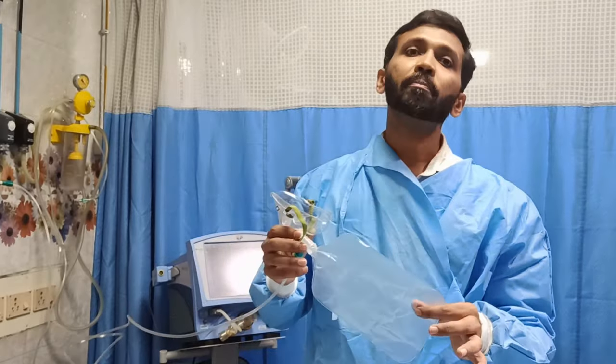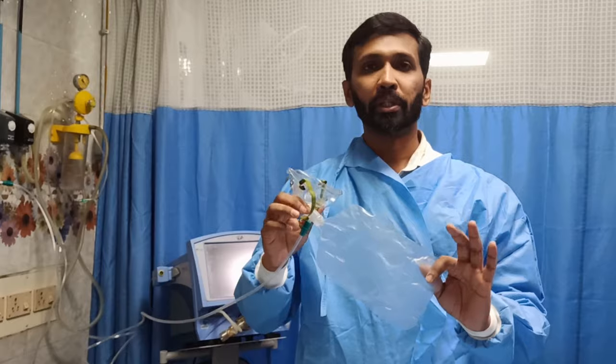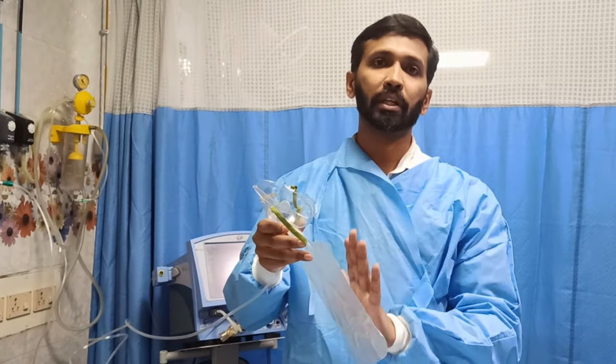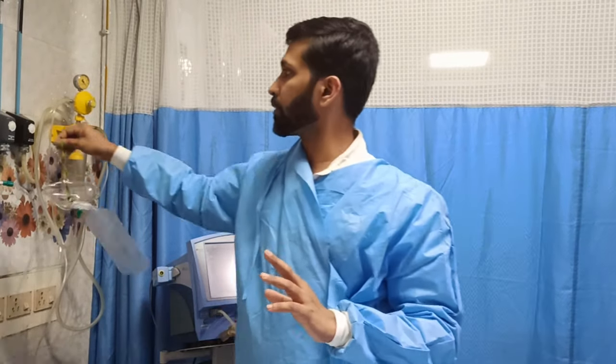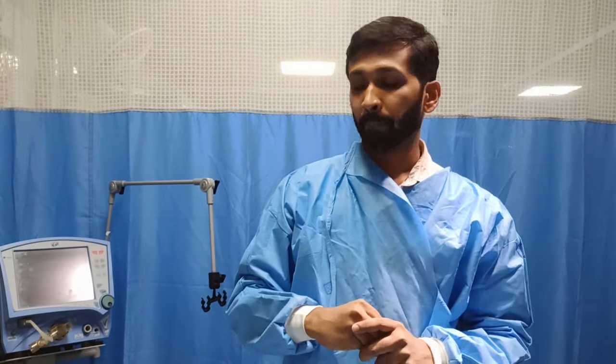So using an NRBM, a high amount of oxygen should be given through a flow meter, and then only the necessary oxygen will be taken from the reservoir. Okay, so far what we discussed is the low flow oxygen devices. Now we will discuss one of our major high flow oxygen devices. As we previously discussed about HFNO, high flow nasal oxygen, that link you will get from the description. You go through this and find out how to use an HFNO. Here we will discuss a CPAP.